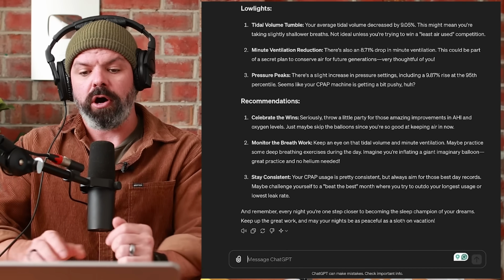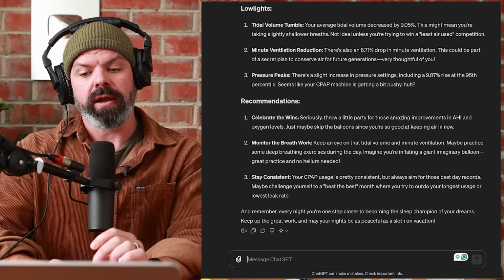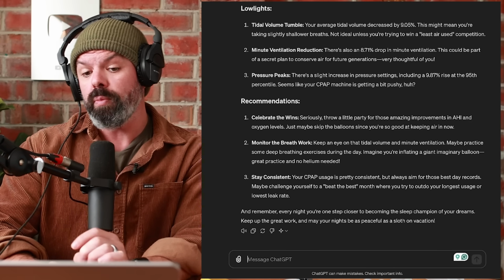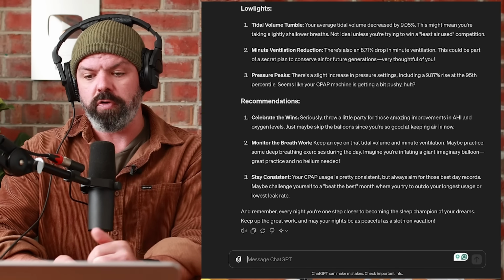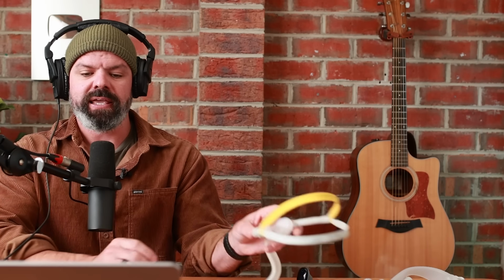Lowlights. Tidal volume tumble. Your average tidal volume, well, this is interesting, decreased by 9.05%. This might mean you're taking slightly shallower breaths. Not ideal unless you're trying to win a least air used competition. So what they're saying here is with the Solo, there was slightly less air traveling into the lungs with each breath. And if you think about it, that makes sense. I mean, with this mask, you're breathing air in through your mouth and your nose, and with this, just your nose. So slightly less air, not a big deal.